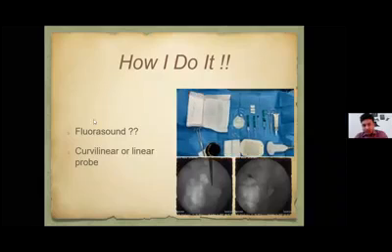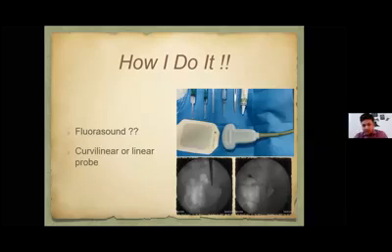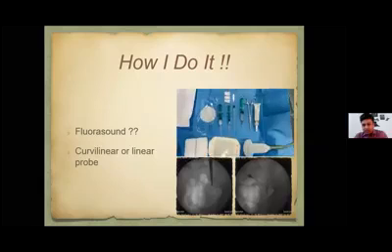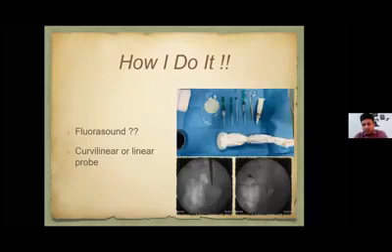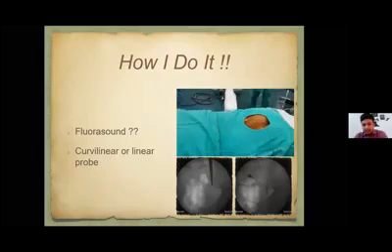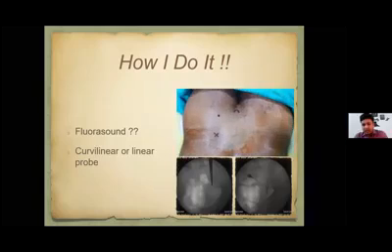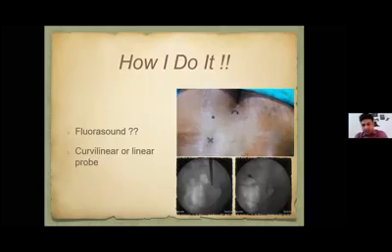These are the equipment requirements that we use. This is the curvilinear probe. We can use a linear probe also in thin patients if it is not that deep. Otherwise, you can use the curvilinear probe. The patient is lying prone. We can mark the sacral hiatus and sacral cornua. We can mark the PSIS with a cross mark, and the dot is the probable intervention site.